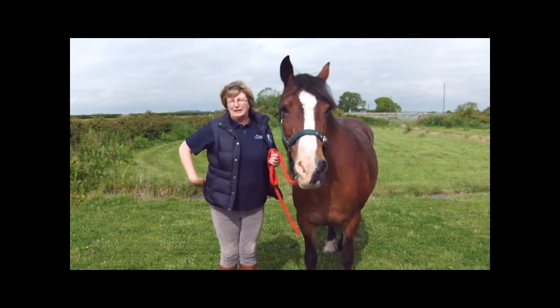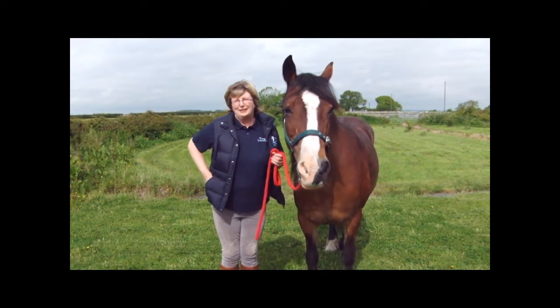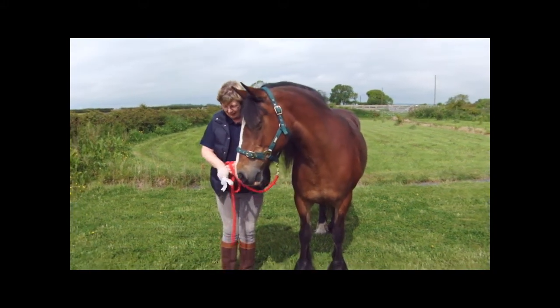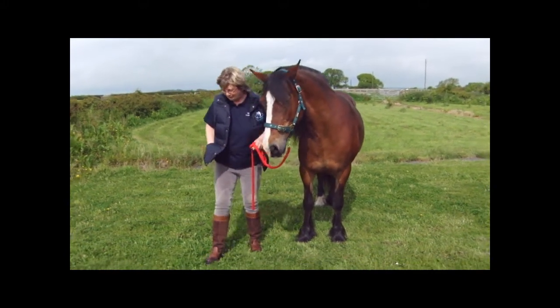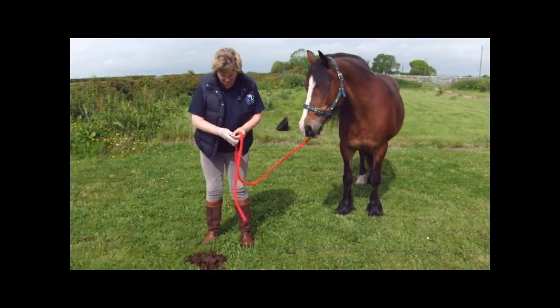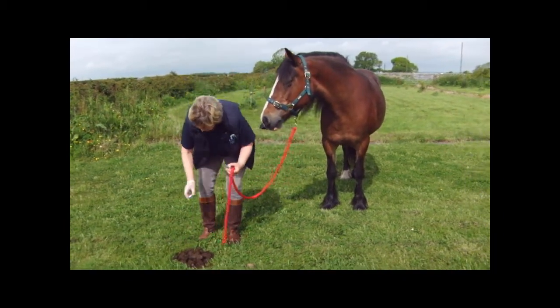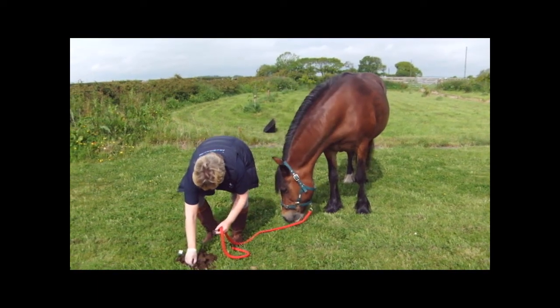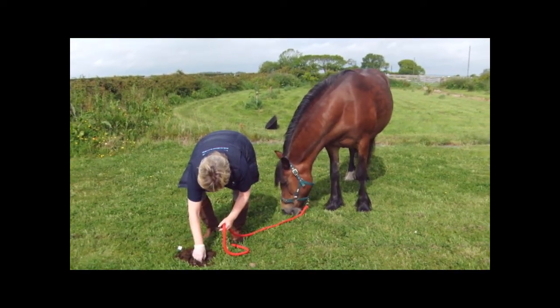First of all, we need a nice fresh pile of dung, which we've got here, and put on the glove that's been given in your pack. We'll go to the sample and take a small pinch from different parts of the dung pile, just to make sure you get the most accurate test you can.